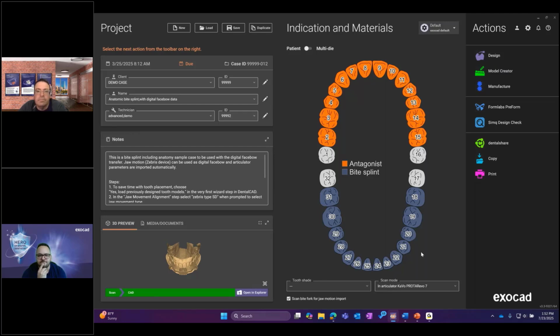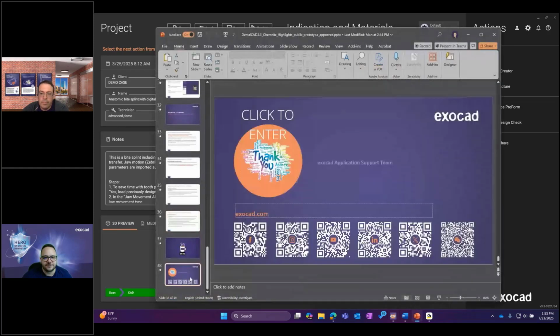Yeah. And then in those change logs or release notes, like Lucas was mentioning, one of the big features for 3.3 partial CAD is that it's going to share that split denture functionality. It's just a different variant, so users will be able to utilize the different workflows for different situations. And at the end of the day, it could fall down to a preference as well. So both workflows are pretty slick, and we got a lot of great feedback at IDS when we were demonstrating those.